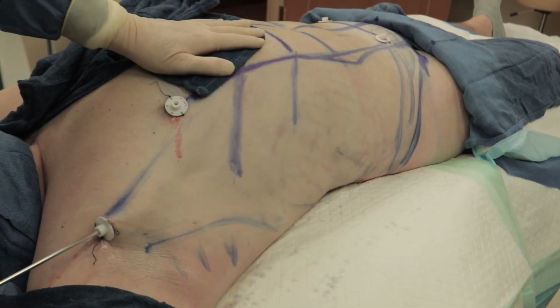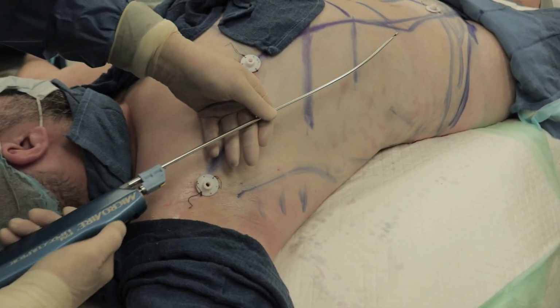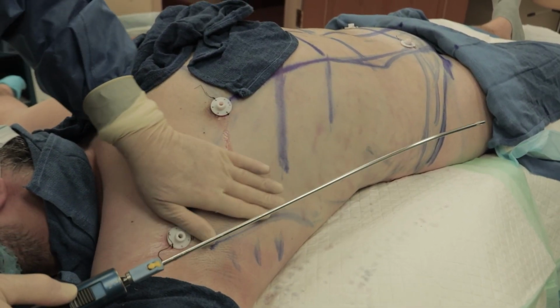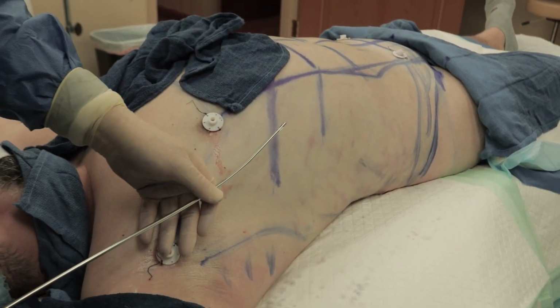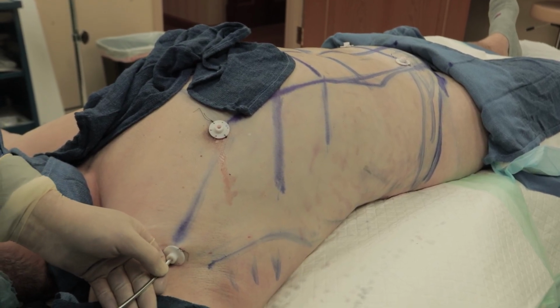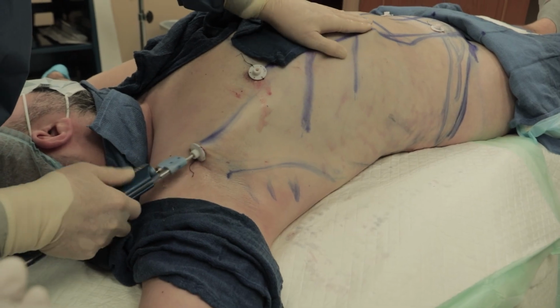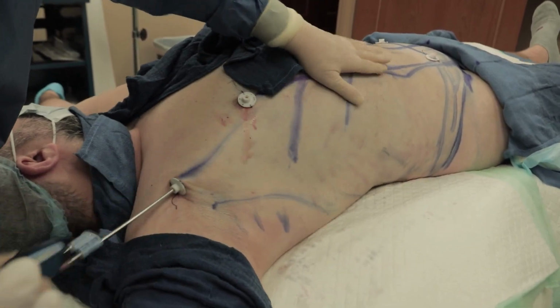So again, let me show you. It's 20 degrees, so I can scoop it this way, get around, and then scoop it this way so I can get in by this scoop. Be careful of the ribs, turn it, and go around to the belly. And I constantly know where I am.